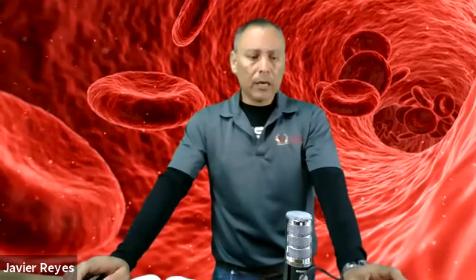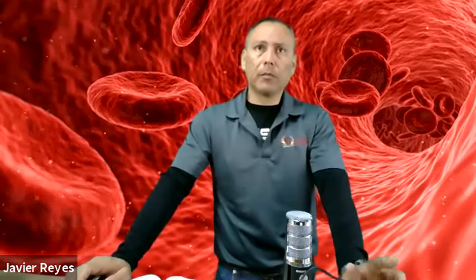The special precautions are necessary during blood collections by venipuncture and capillary puncture. If you do collect a venous specimen and you place it in a capillary tube, make sure that you label the specimen as venous so that the technologists can understand and use the different reference ranges for the different types of specimens. So remember that.